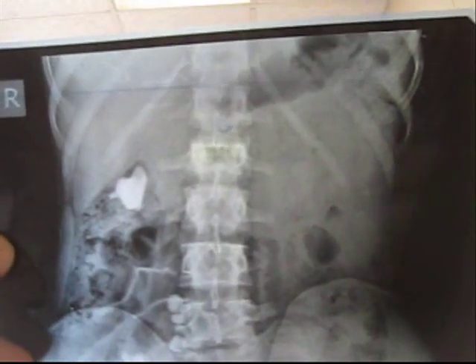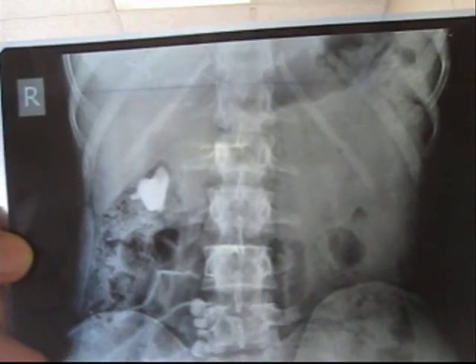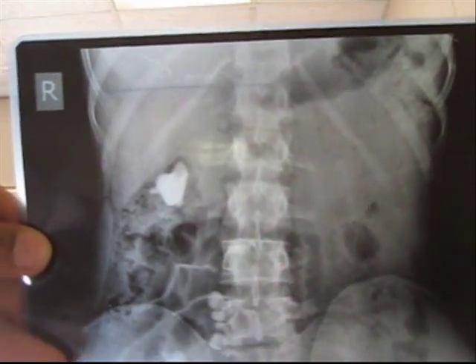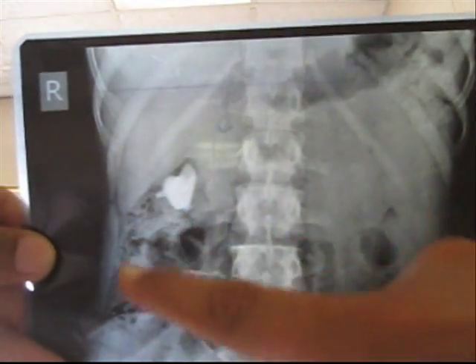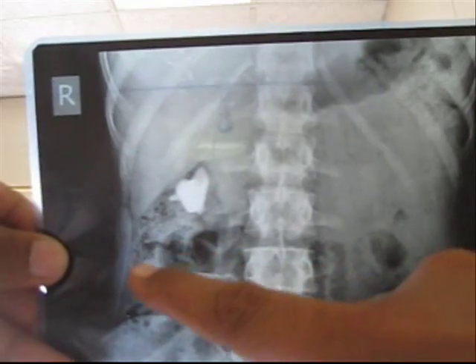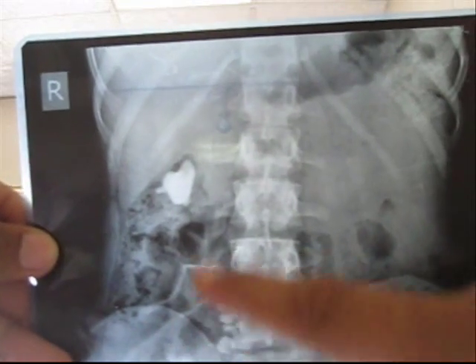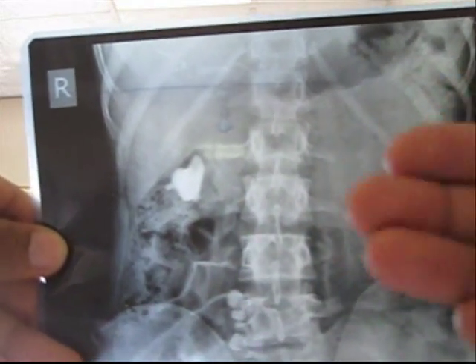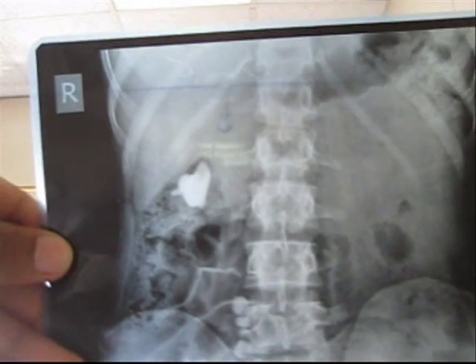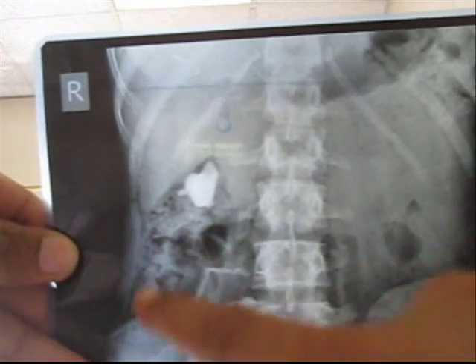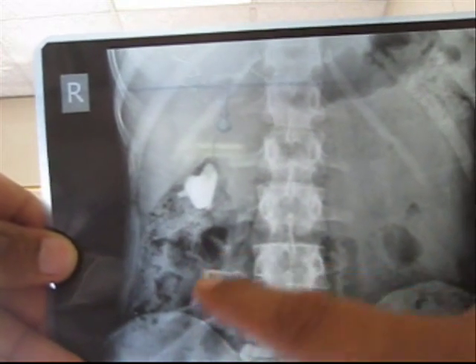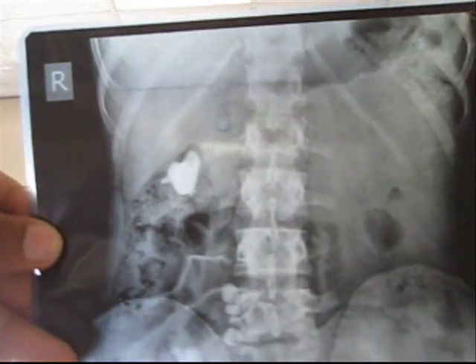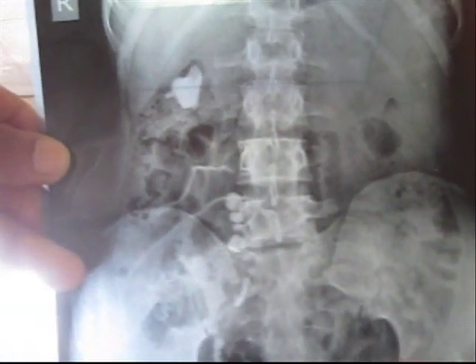This is the same X-ray KUB of the same patient. However, here you can see radiolucent shadows along with the radiopaque shadow described earlier. This radiopaque shadow may be of feces in the intestine.